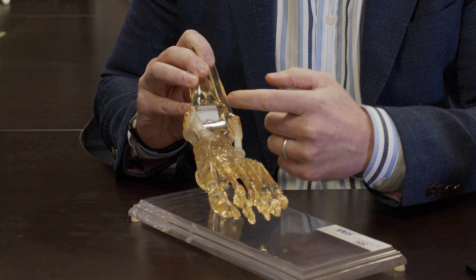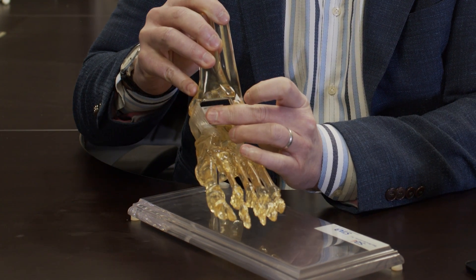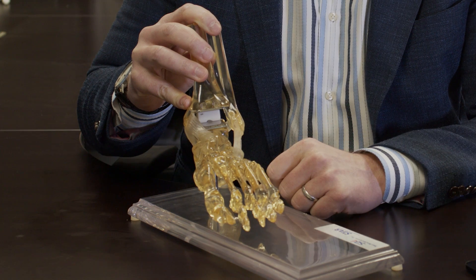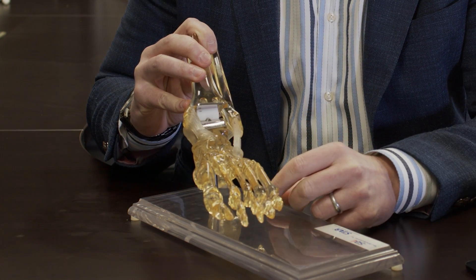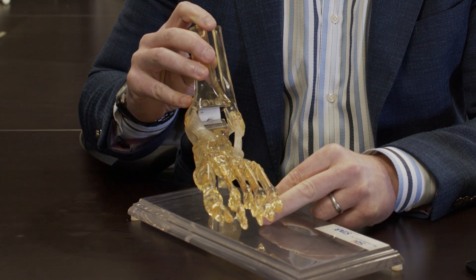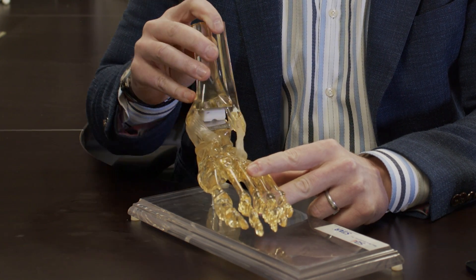Once we've completed that, we insert a piece of plastic based on how loose the ankle replacement is. When we're done, we have two metal caps with a plastic spacer or bearing in between, and this allows more normal kinematics or ankle motion.